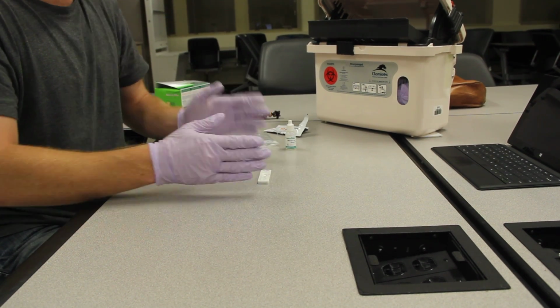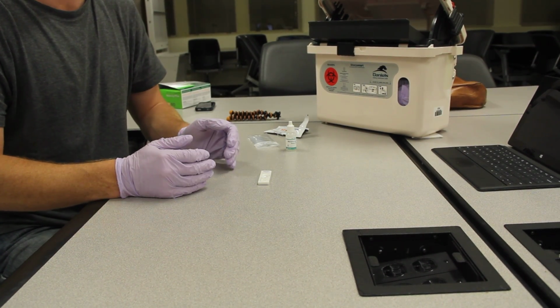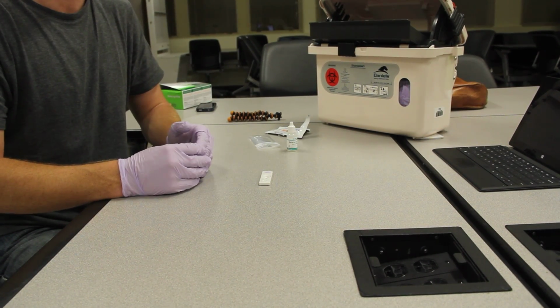And now the next step here is we just wait about 15 minutes, depending on the instructions.